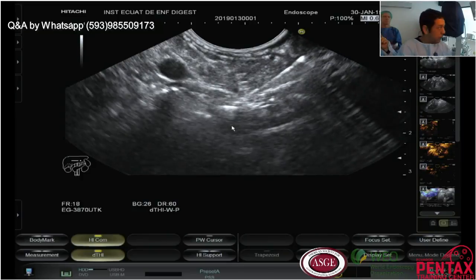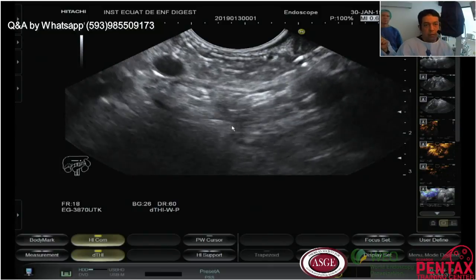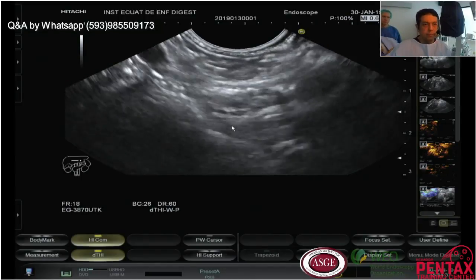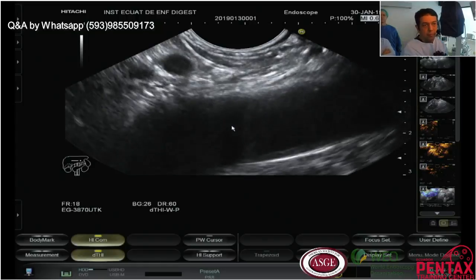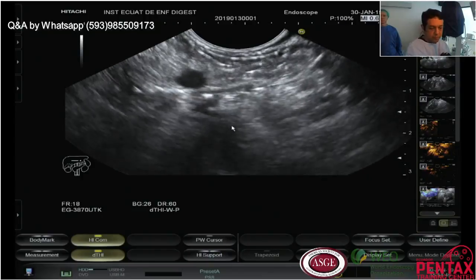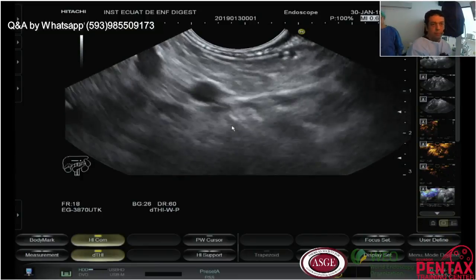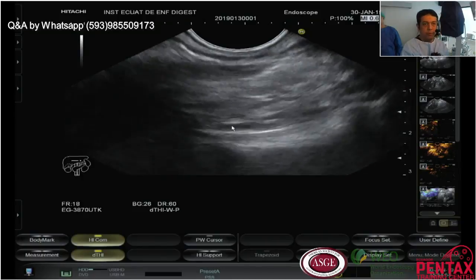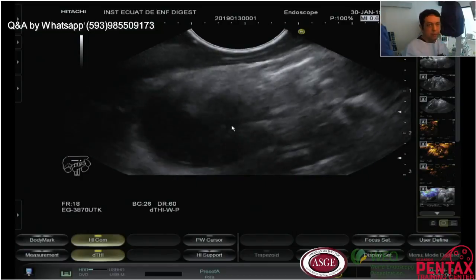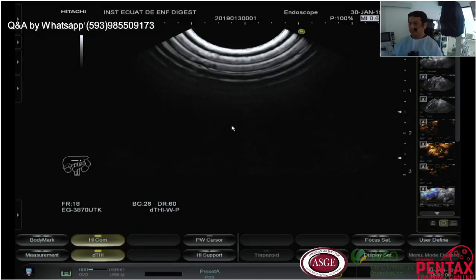Finish. You need to see the pressure. The blood pressure is perfect. And we finish. Okay. So that's all. I will continue without cameras. I will perform the ERCP just to put a metallic stent, fully covered in this case. And we finish the transmission. Thank you.